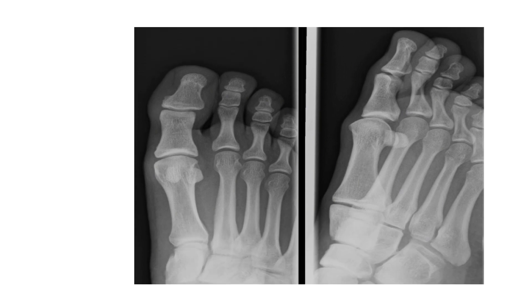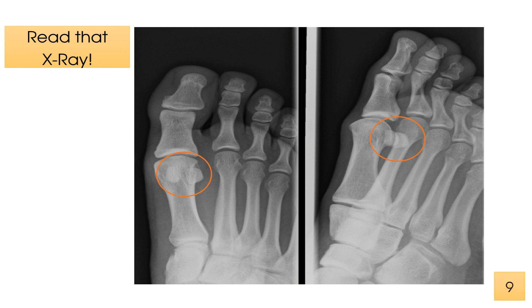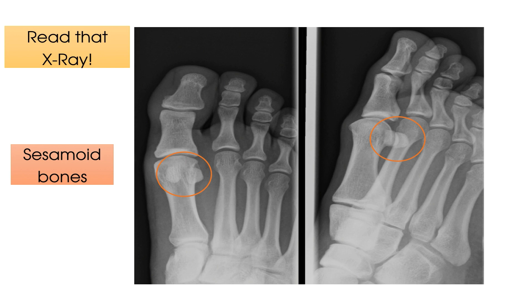Here's X-ray number two. What do you think is going on here? Read that X-ray. Time's up. So actually, this X-ray is a bit of a trick question. The white mass-like structure is actually the sesamoid bones, and so the answer is there is nothing wrong with this X-ray. We wanted to throw this one in, as when therapists are first starting to interpret X-rays, they may think they have found a foreign body or perhaps something more sinister when they look at the toes — when actually, this presentation is entirely normal.